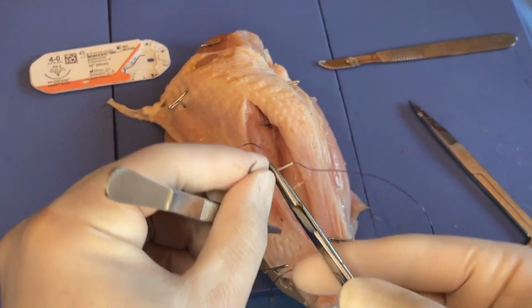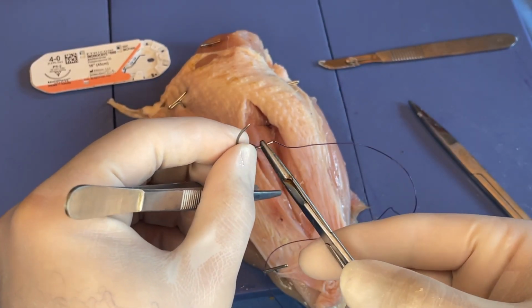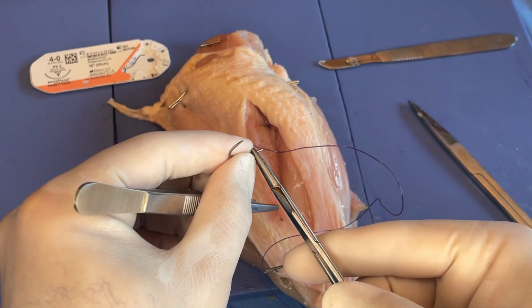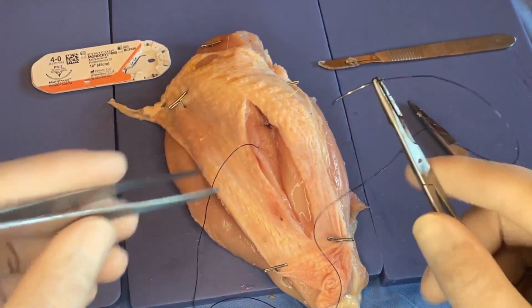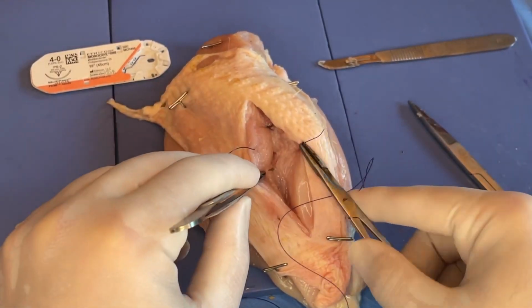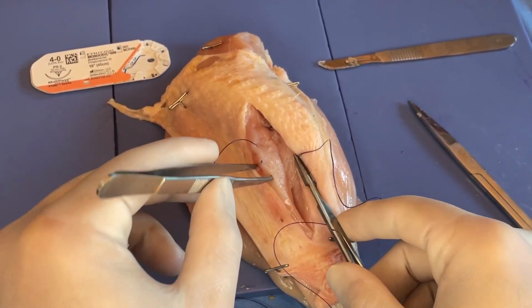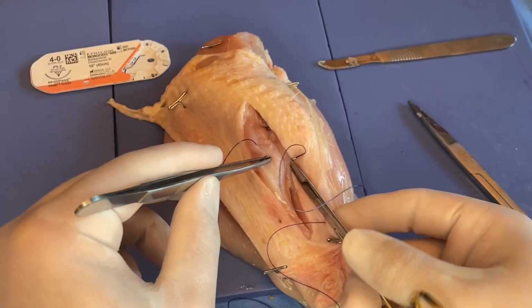If I did want to try to do it in one bite, I'd have to really choke back on the needle. Again, we don't want to grab way out here with this wedged in, because it might, in crushing that, detach the suture. But if I back way off, I might be able to do it, so come across there, and then come across there.